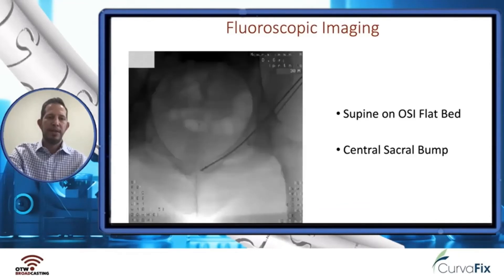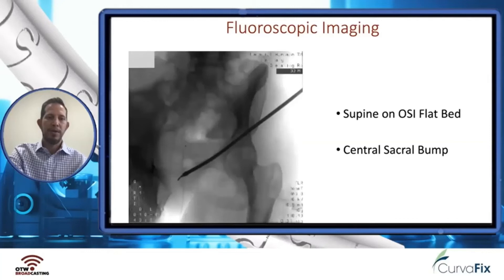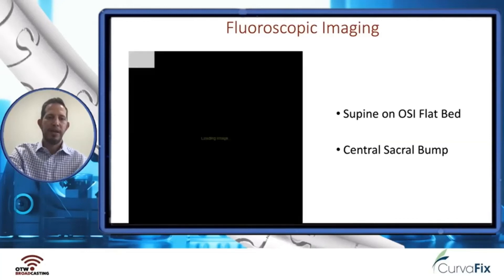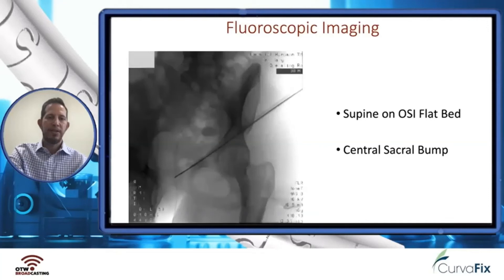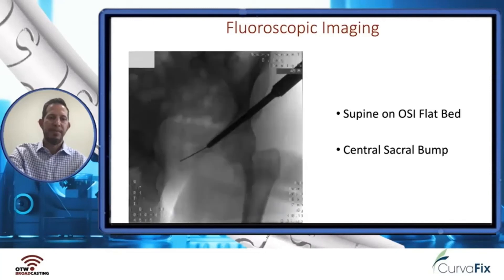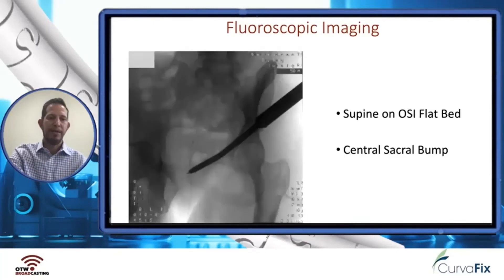Here you can see us preparing to ream, and then we proceed with the reamers. Here it is on an obturator outlet image. You can see the countersink going in, and the exchange tube changing out to a non-vaulted guide rod. Here you can see the rod screw being inserted past the acetabulum, past the obturator ring, and then docked on an obturator outlet image.